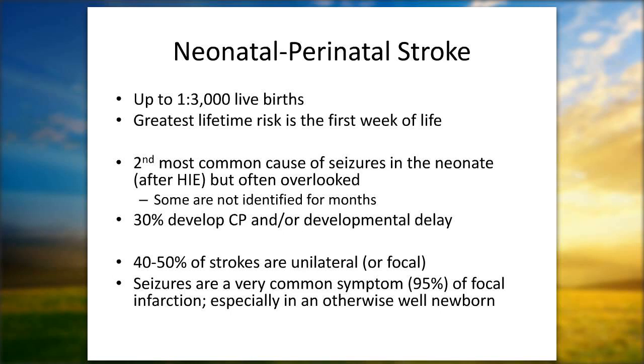So, I'm excited. Gabriel, you said you maybe have a picture of a baby with severe IVH that showed asymmetry, and definitely I think there is for sure that theoretical possibility and obviously realistic possibility. And if you've got a tracing of it, I would love to see it and include it for people in the future. But definitely something to think about in those preemies if you're monitoring who are at risk for bleeds, for sure keeping that in mind. So great, love it if you want to send it.